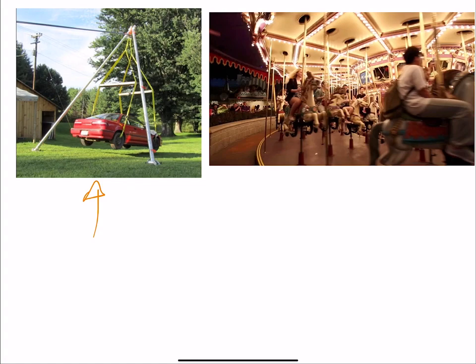And you do that all the time. Like if you try to push someone on a swing, if you push them at the wrong time, it's not good. So you always got to push them at the right time. So essentially that's what we're doing with RF excitation.